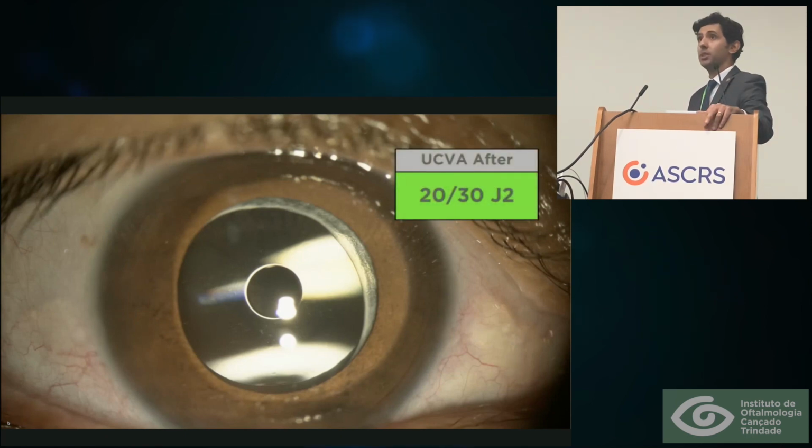And this is how the patient did after surgery. An amazing improvement. And we cannot highlight enough that this was not only caused by the pinhole itself. We know the benefit of the clear lens extraction in keratoconus or in cataract surgery.